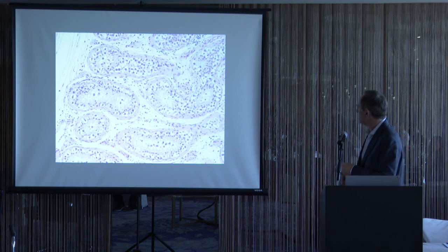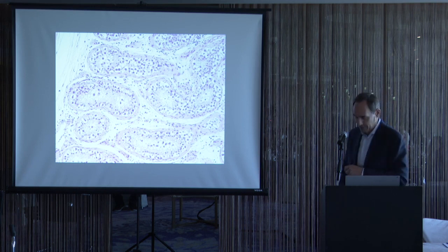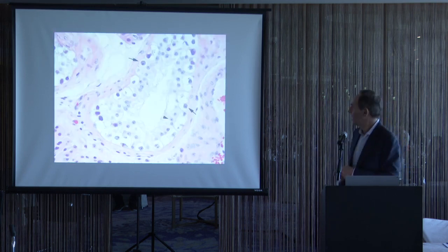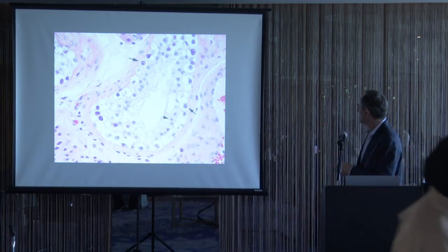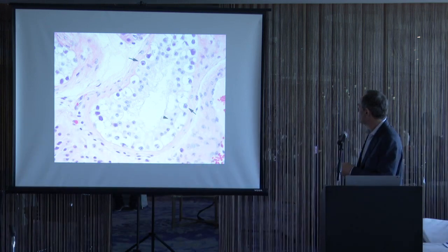And you can spot germ cell neoplasia in situ even at low magnification. The nuclei stand out with these halos around the outside. They're always at the perimeter of these seminiferous tubules, again, lacking any sperm production. And at higher magnification, the Sertoli cells have the smaller nuclei, very delicate chromatin with a very small, uniform central nucleolus, whereas germ cell neoplasia cells will have more irregular, prominent nucleoli and more hyperchromatic nuclei.